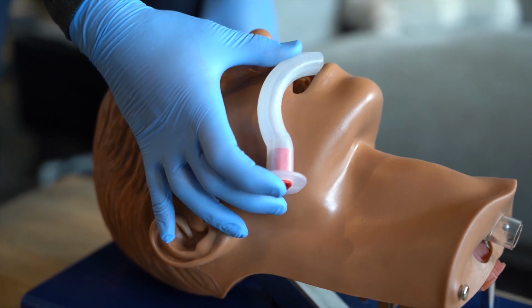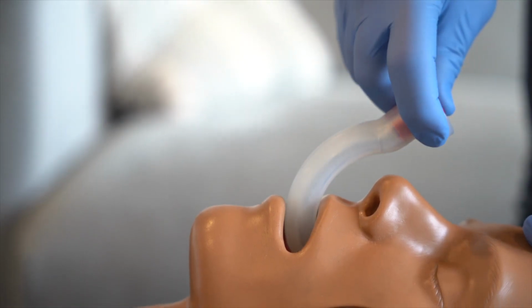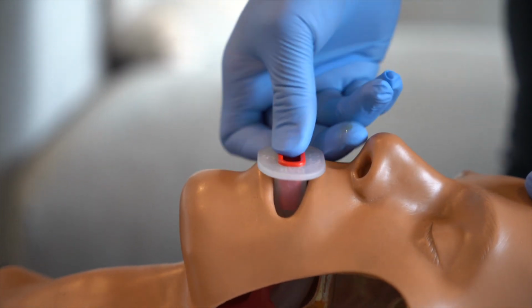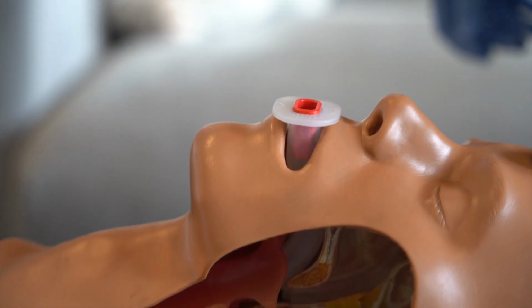After a patient's airway is cleared of soft tissue obstructions using manual techniques, it is important to ensure that it remains patent and does not re-occlude. This is where airway adjuncts such as an oropharyngeal or nasopharyngeal airway are useful. A properly fitted OPA prevents the tongue from falling back against the posterior pharynx and also assists in keeping the mouth open. To select the correct size, measure from the center of the patient's incisors to the angle of the jaw. Next, place the OPA into the oral cavity with the tip facing the roof of the mouth. Once inserted halfway, turn 180 degrees and continue to insert the OPA until the flange rests against the patient's lips.